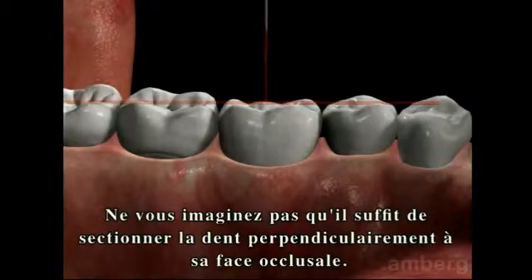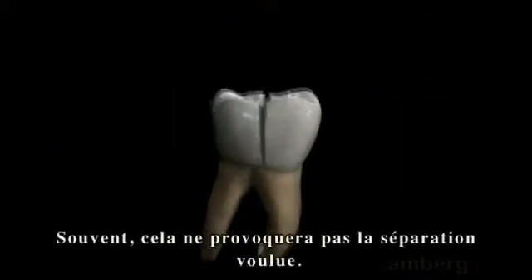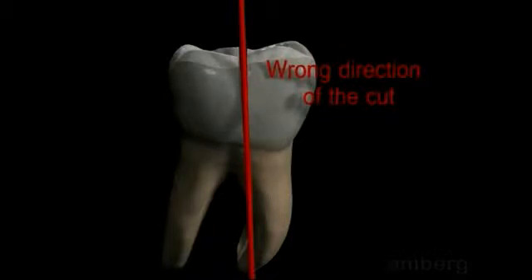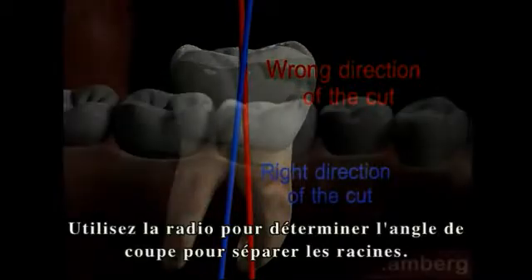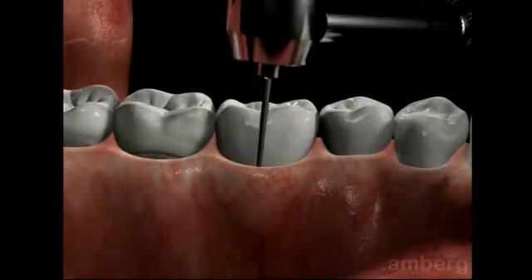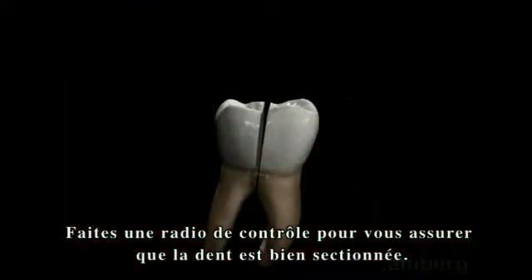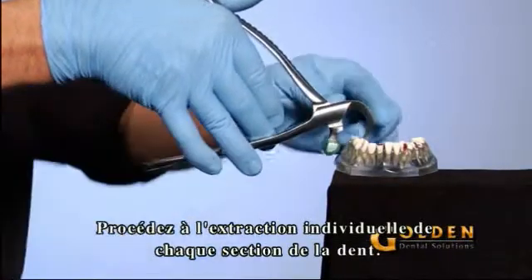Do not assume that you can simply section the tooth perpendicular to the occlusal plane. Quite often, this will not necessarily accomplish a separation of the root. Noting the x-ray, angle the drill according to the angle of the root. Take another x-ray to ensure the tooth has been completely sectioned. Use the physics forceps to remove each individual section of the tooth.